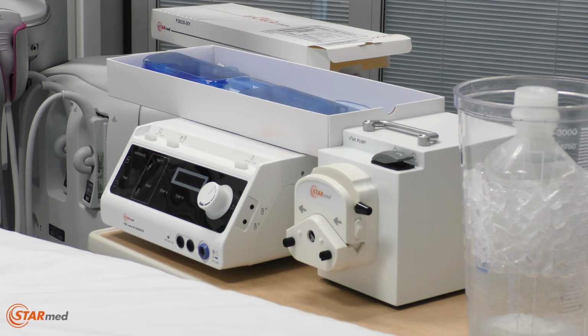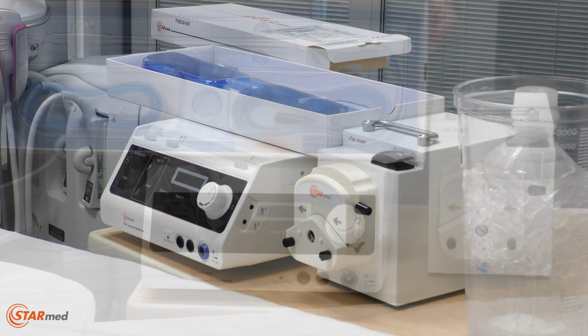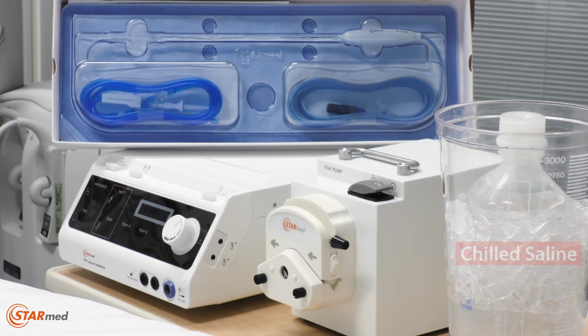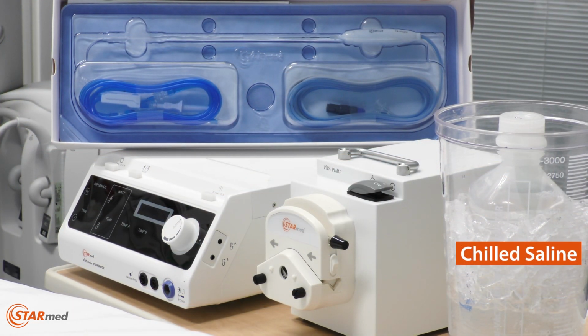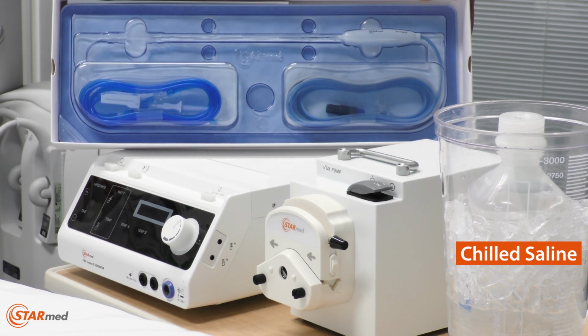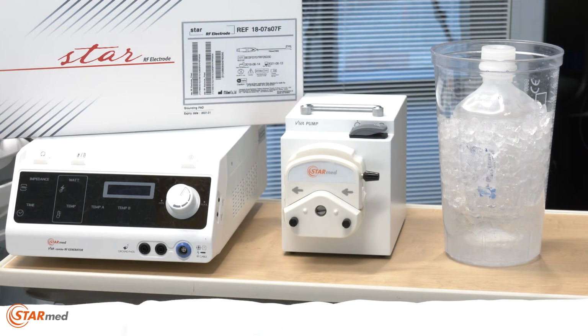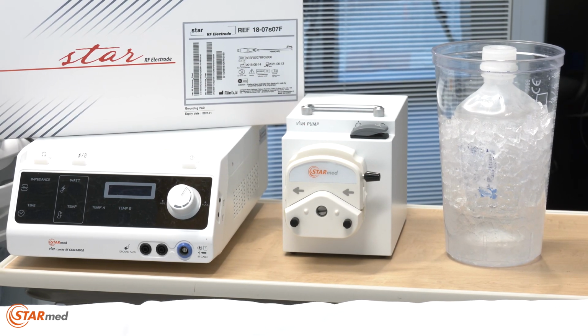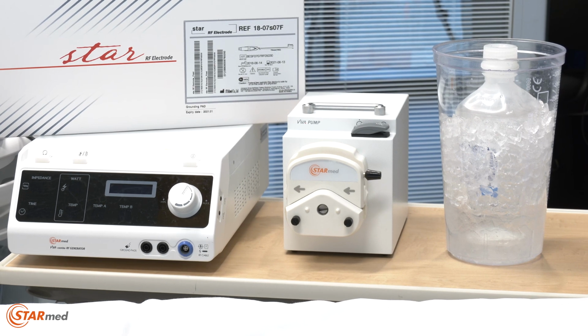First, let's introduce the three main parts of the VIVA Combo RF system: the VIVA Combo generator, the pump, and the RF electrode. You will need to prepare chilled saline for the electrode's internal cooling system and a container for the solution's outflow. It is recommended to keep the internal cooling at around 10 degrees Celsius throughout the procedure.